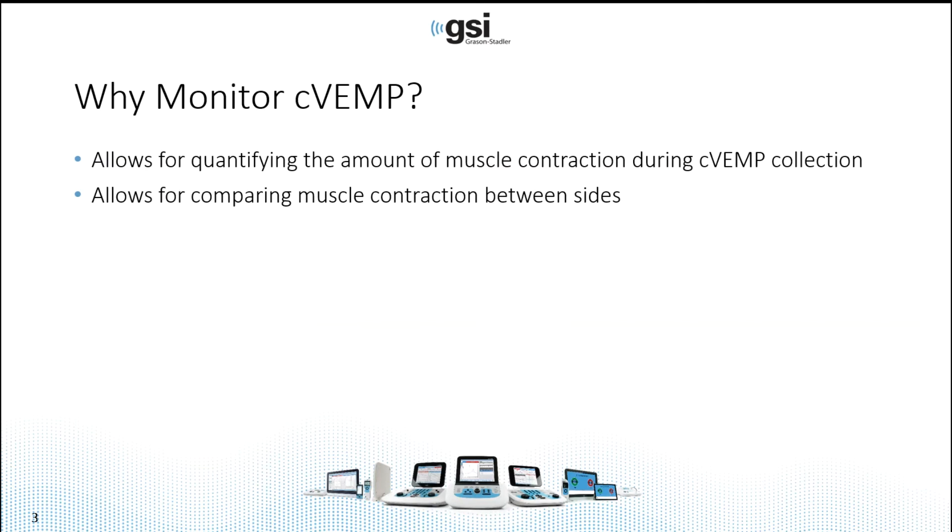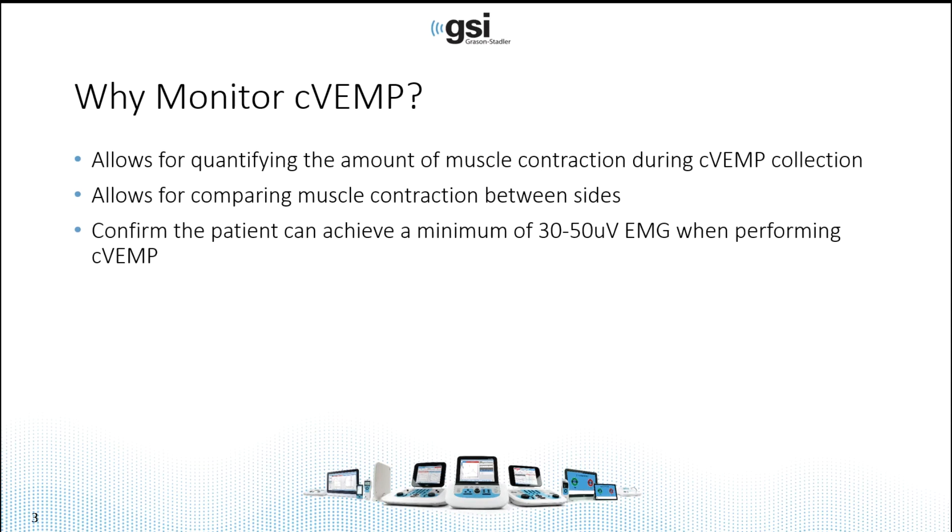Monitoring during C VEMP allows for quantifying the amount of muscle contraction during a VEMP collection, and therefore allows you to compare the muscle contraction between sides. It also allows you to confirm that the patient can actually achieve a minimum of 30 to 50 microvolts of EMG when performing C VEMP. A significant contraction is required in order to collect this potential.